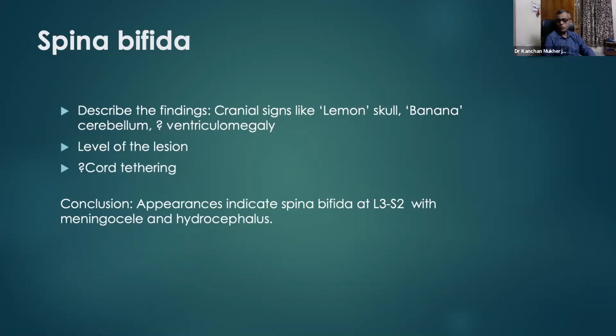Even if you do not want to write the prognosis level, the person reading, suppose this fetus, this condition is detected at a later date, at 28 weeks, and then they have gone to a neurologist, pediatric neurologist. They would like this information to prognosticate this baby.